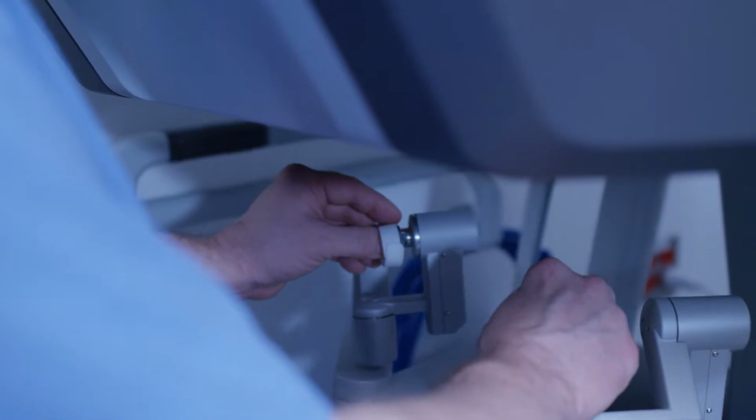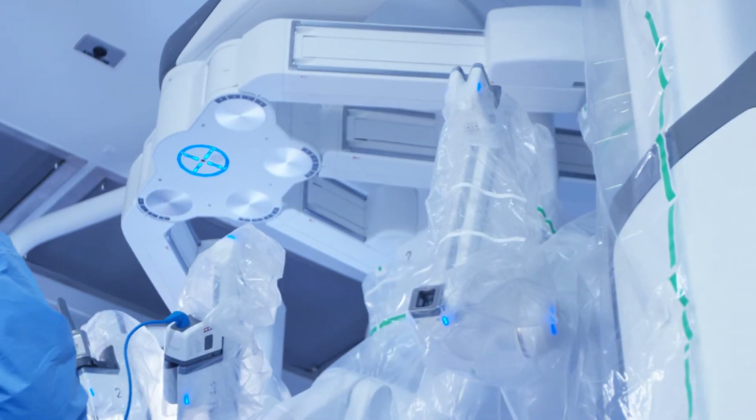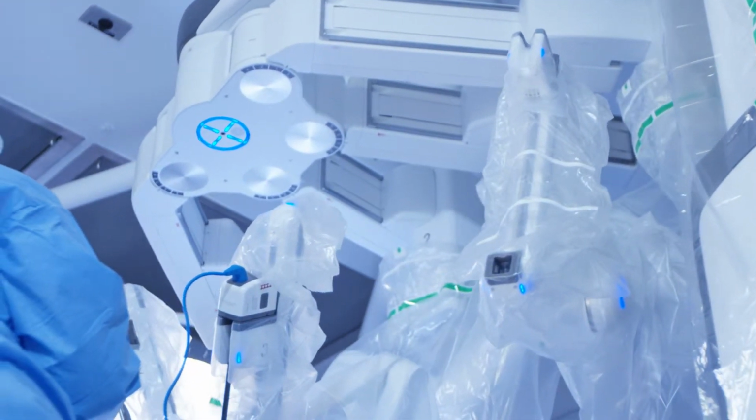It's either resectable or it's not resectable. If it's resectable, you should be able to do this with the robot. And the advantage is, now, the classic way of doing, for instance, let's say you find an anterior mediastinal mass that we either need a biopsy or we need to remove it. Sometimes the tumors are benign, but they're growing at a rate that's going to cause trouble. And so sometimes the benign tumors need to be removed.